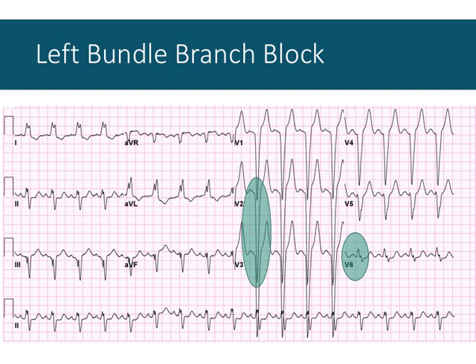A word about placement of the electrodes. One, they might be in some sensitive areas, so respect, obviously, for your fellow classmates. And two, if the placement of the electrodes is impeded, if you have hair in the way or anything, you might want to prepare the location for electrode placement first, because we don't have razors in lab, and you might not want to do that in the middle of lab while everyone's there. Or you can opt out of doing it.